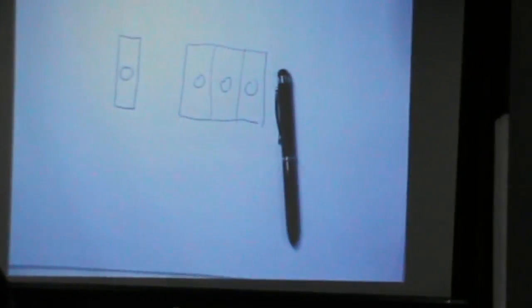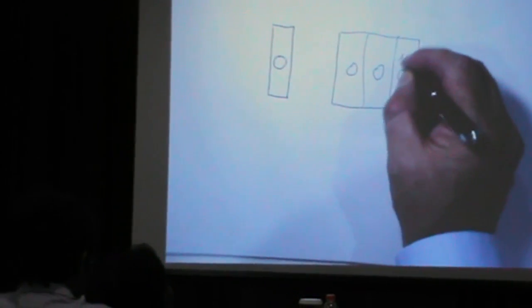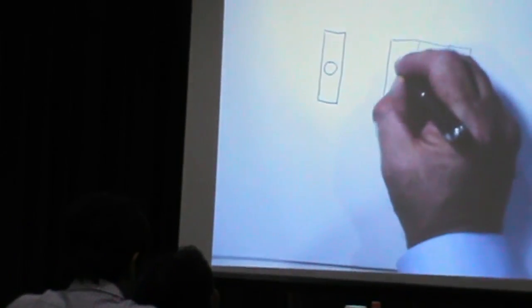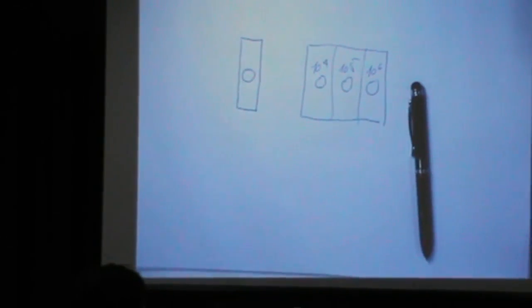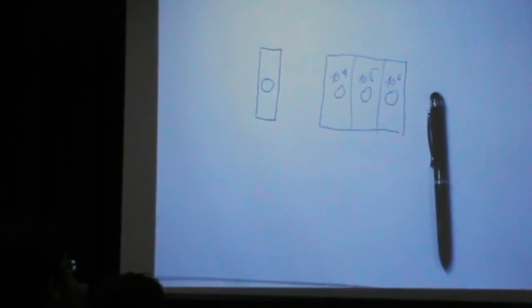One disc is 10 to 6, another disc is 10 to 5, and the other disc is 10 to 4. So you have a kind of bracket of population in order to better understand the log reduction that your process is giving to the BI.